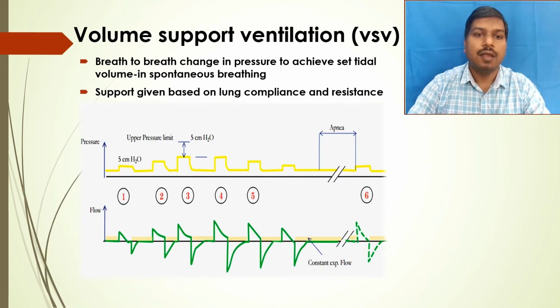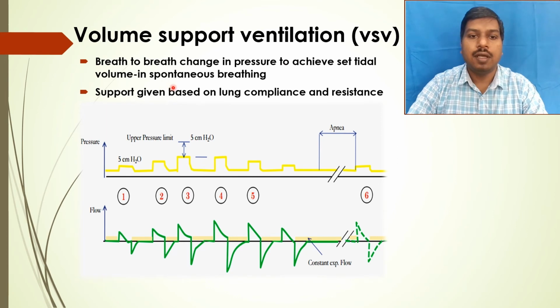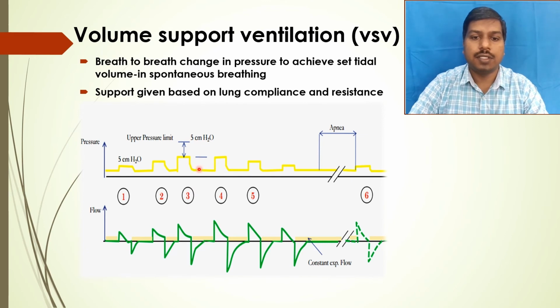In volume support ventilation, it is similar to pressure support ventilation. In a spontaneously breathing patient, if the tidal volume is not met, it will increase the pressure support given and will try to deliver the set tidal volume.